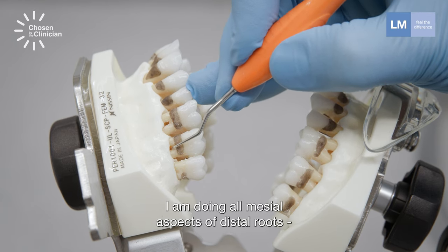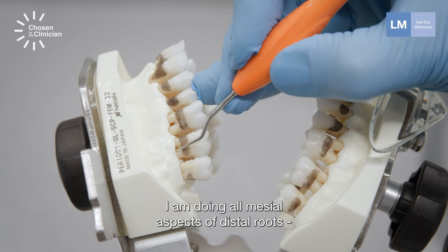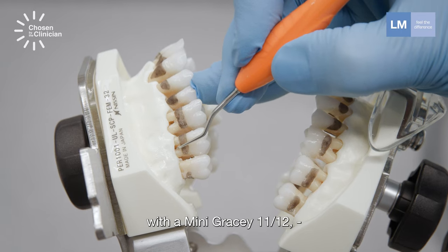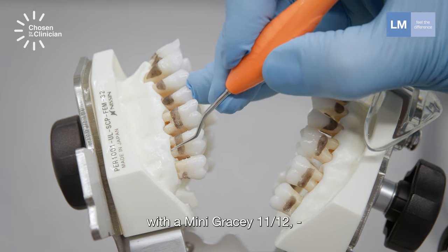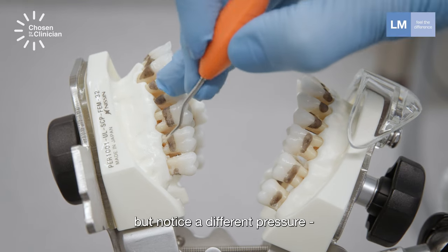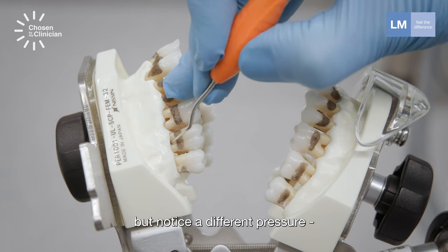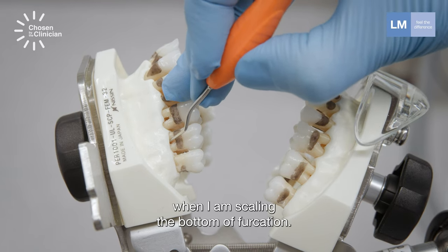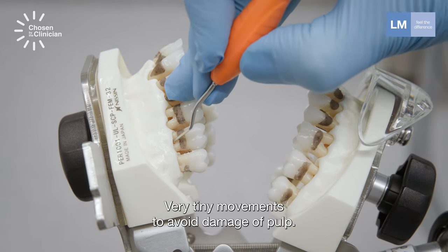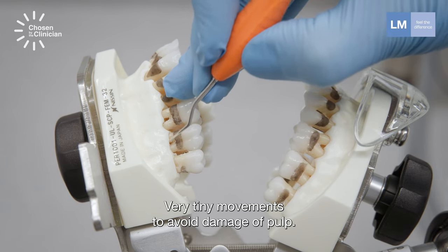I'm doing all mesial aspects of distal roots with mini Gracey 11-12. Using the same instrument, but notice the different pressure when I'm scaling the bottom of furcations. Very tiny movements to avoid damage to the pulp.